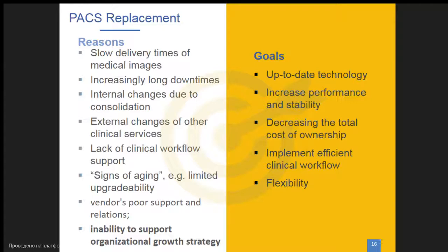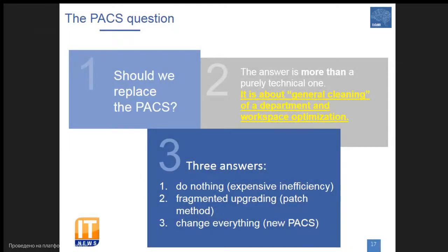The first one is to have up-to-date technology, increase performance and stability, decrease the total cost of ownership, and at the end of the day, the new system should be flexible. So when you ask the question, should we replace the PACS? The question is not just about technology.